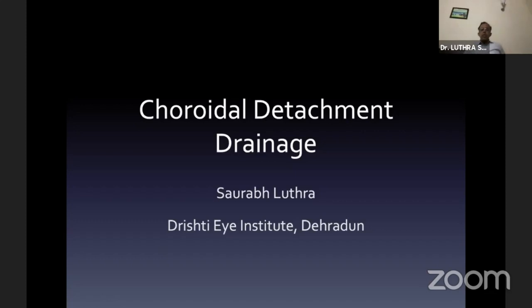Good to go. So as we know, choroidal detachment we often encounter in various settings. It may be associated with a rhegmatogenous retinal detachment or post-trauma. And I'll be speaking mostly on serous choroidal detachment drainage, because the suprachoroidal hemorrhage will be dealt with later.